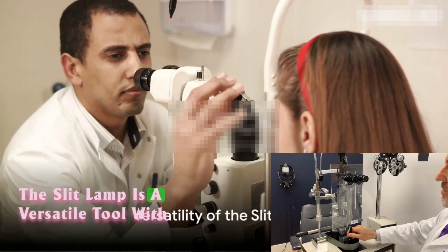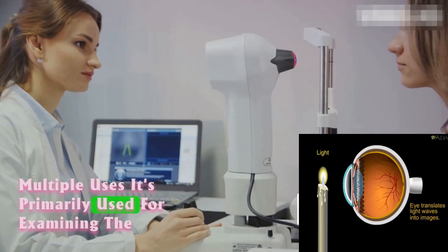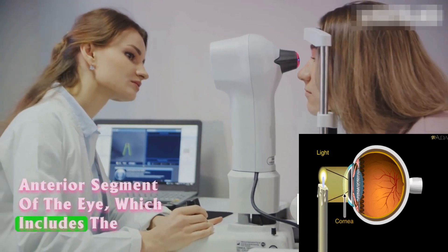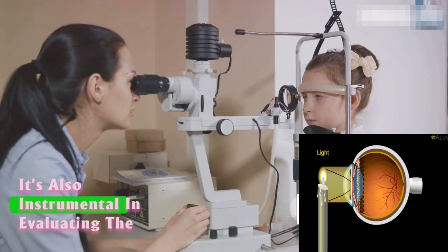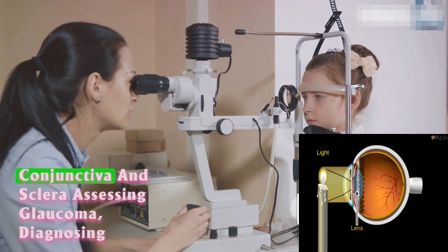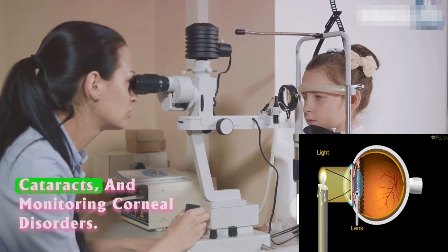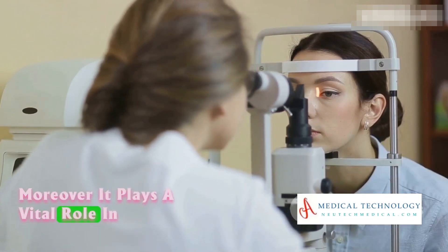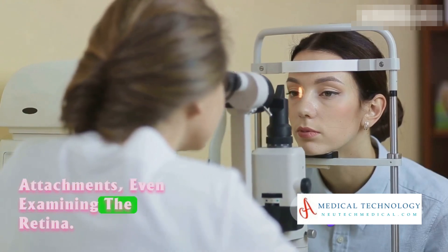The slit lamp is a versatile tool with multiple uses. It's primarily used for examining the anterior segment of the eye, which includes the cornea, iris, lens, and anterior chamber. It's also instrumental in evaluating the conjunctiva and sclera, assessing glaucoma, diagnosing cataracts, and monitoring corneal disorders. Moreover, it plays a vital role in fitting contact lenses and, with the right attachments, even examining the retina.